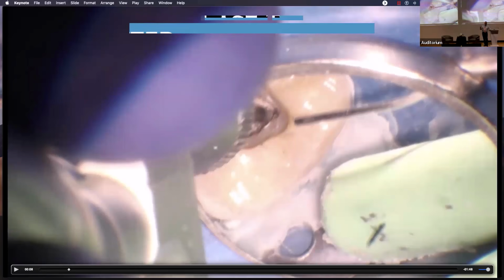If you remember, very early on when we went through the zirconia, we used a ton of water. That very initial step of getting through was a ton of water. We clear out the zirconia so that we're not touching it on subsequent access steps, hence the larger access through the restorative material, and then stepping down and working dry inside of that smaller access.